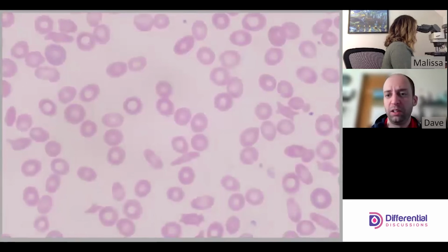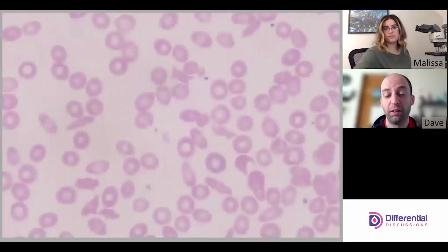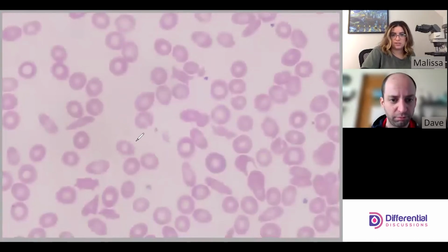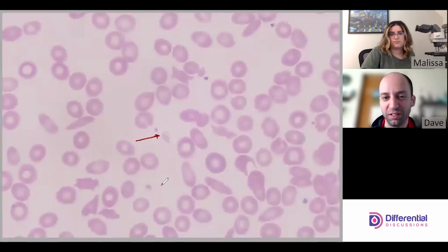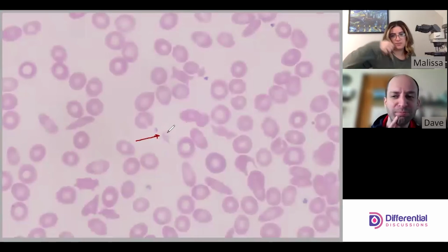I'm gonna come over here because... Wow. All right. So I came over here because there's a schistocyte. Oh, cool. I missed that. There it is. Yep. Cool. So I wanted to show him because he also has uneven projections. Sure does. So why isn't it an acanthocyte, Melissa? Because he's a fragment. He's not a whole cell.